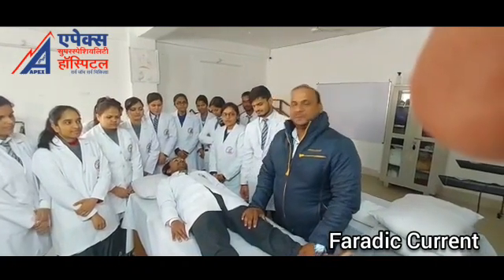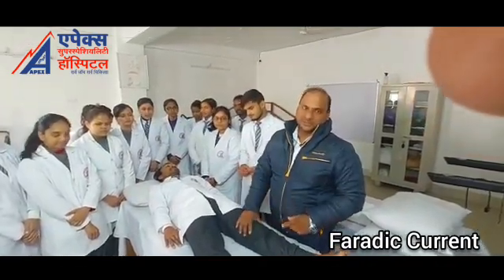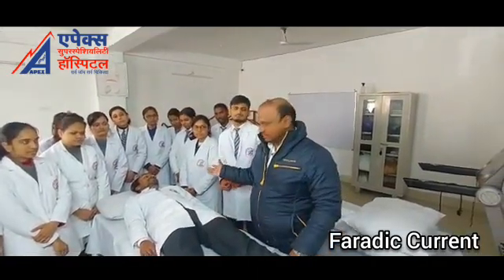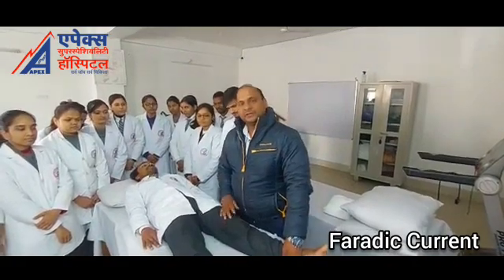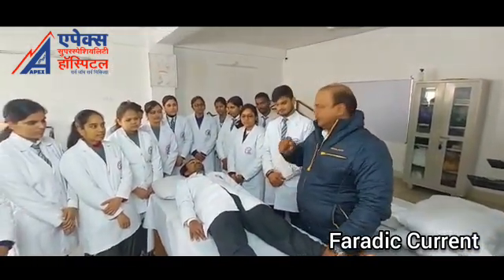I am Dr. Puneet, assistant professor in Apex College of Physiotherapy. Today I am going to demonstrate Faradism under pressure to release the edema. This is our class BPT second year, so we all combine together to learn how to reduce edema by the Faradic current.